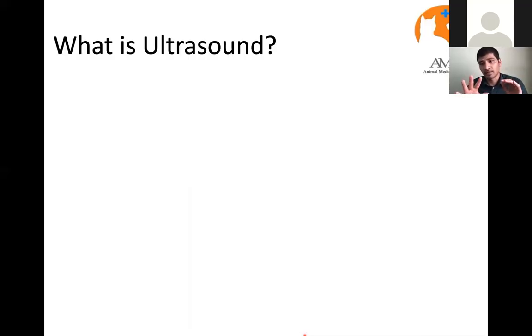We pass the X-ray light, we can say, through some objects, and you get the shadow. So that's a shadow image, but ultrasound is not a shadow image. It's not a shadow imaging technique like the one we use for X-ray. Now we need to understand this, because without it, it's really confusing. Even if you know how to do it, even if you know what is liver, what is kidney, what is urinary bladder, even if you can find them, if you don't understand the basics, then it's really confusing. So let's start with the basics.